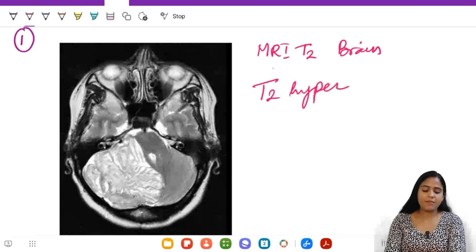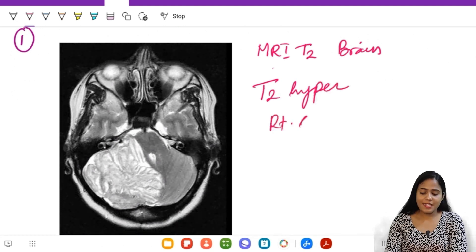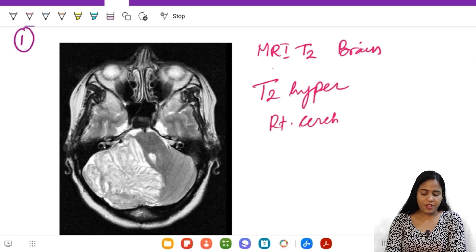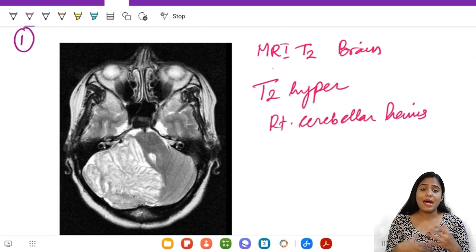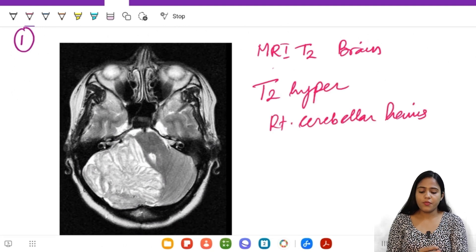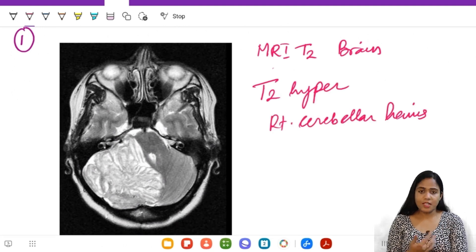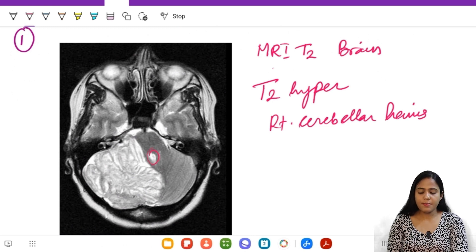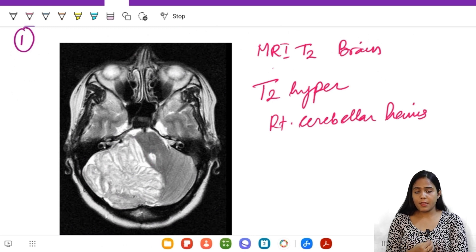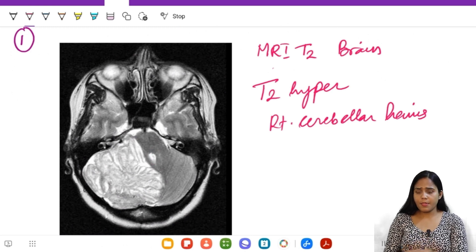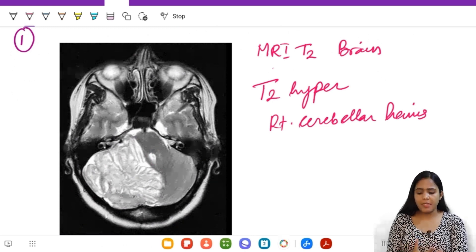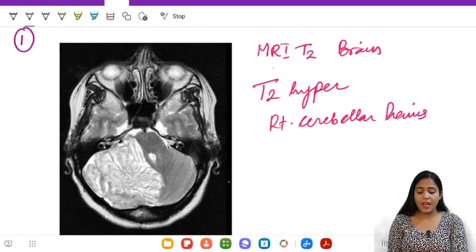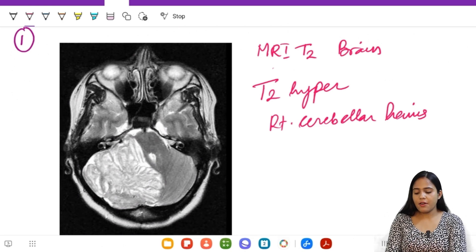There is mass effect on the fourth ventricle, it is almost effaced as you can see here. The cerebellum, the affected pathology, is not just hyperintense. In fact, the cerebellar folia as you can see appears widened.